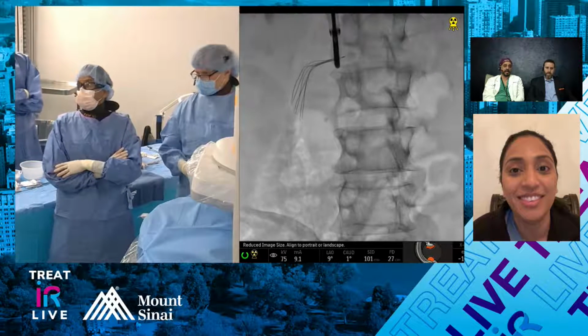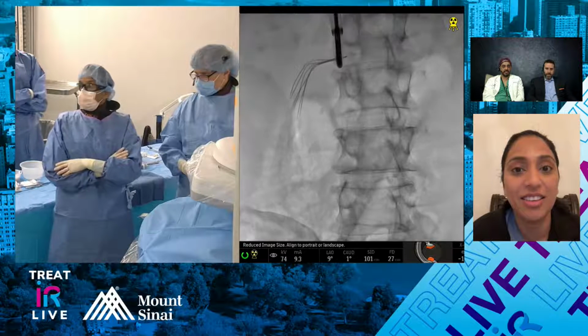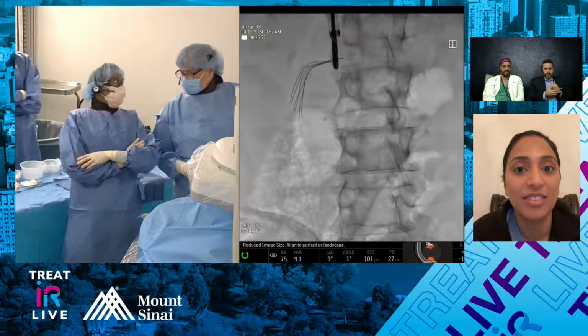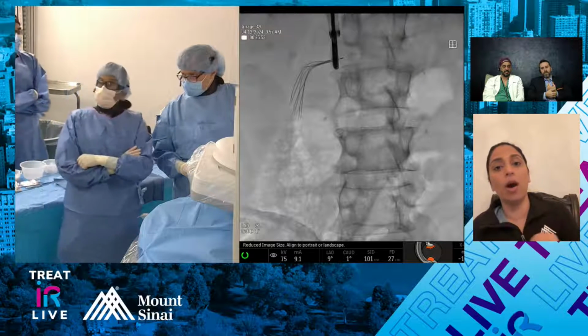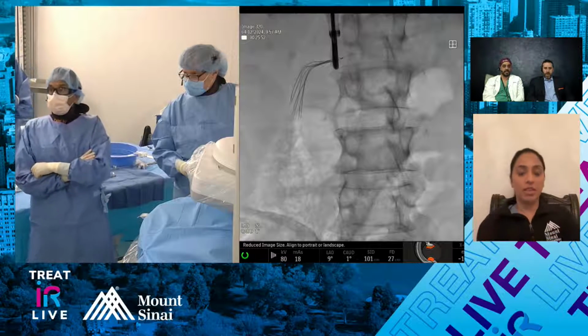You may end up having to take it out just from the groin, right? Yeah, and just invert it. Or if you let it go and then try to reposition the tip, you could let it go and kind of walk it so that it straightens out. Will it fly? It won't fly. You might be able to try to walk it.